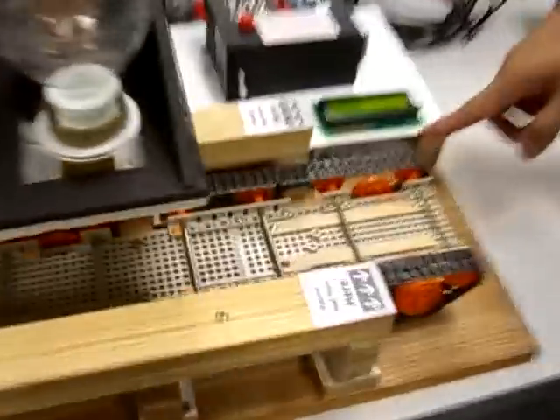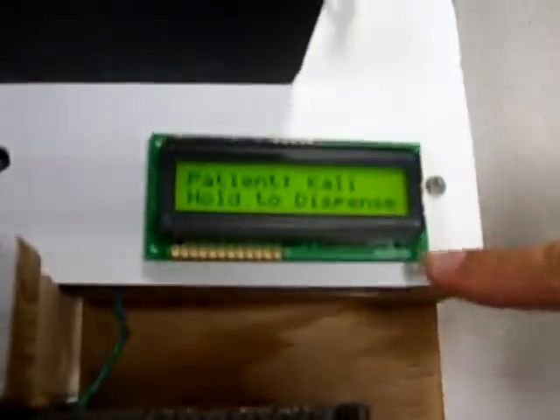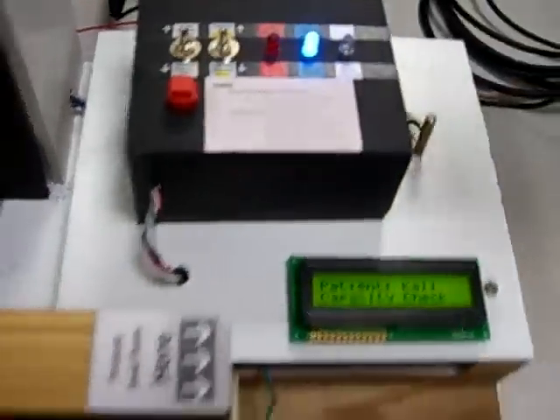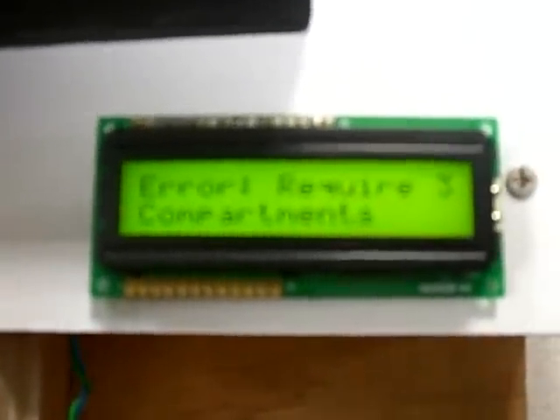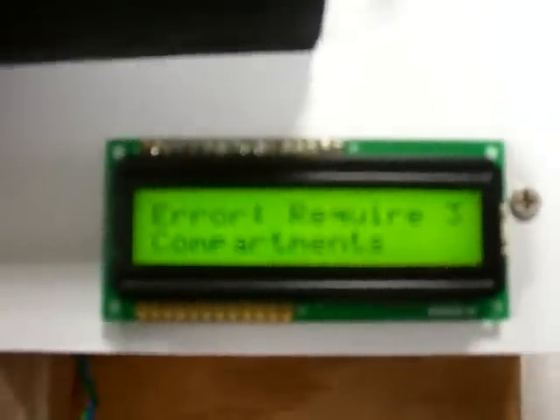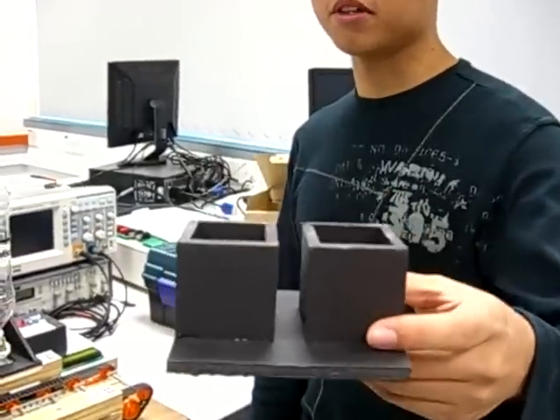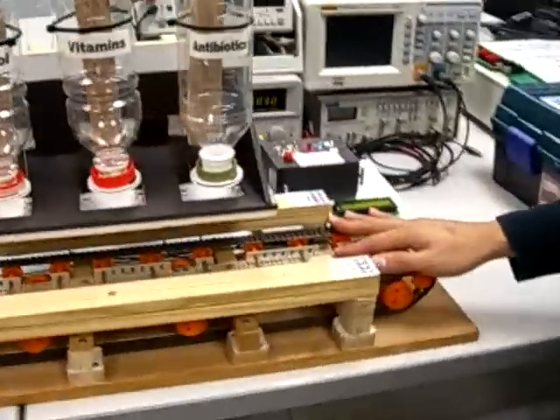Kali — press and hold to dispense. Error: requires three compartments. Dispensing three medicines with two compartments fails. This time, we load from the other end.